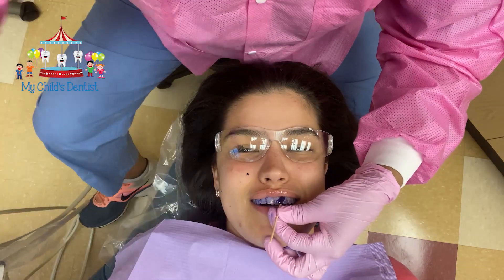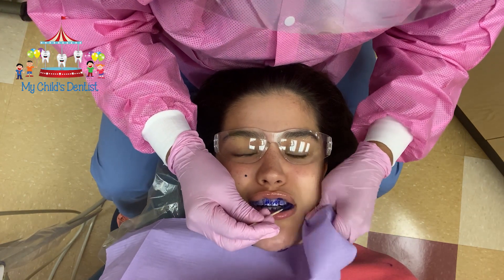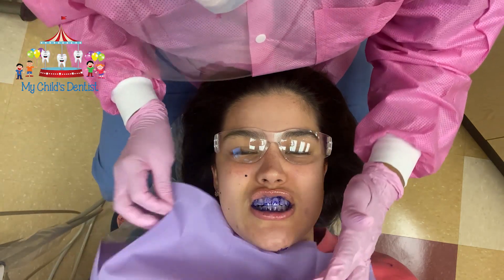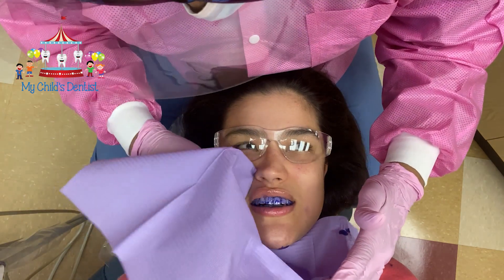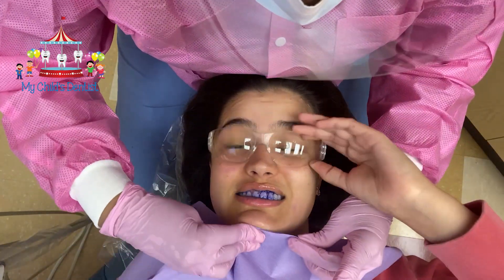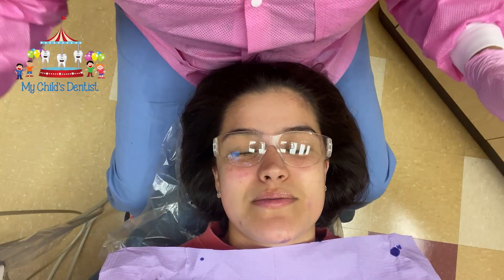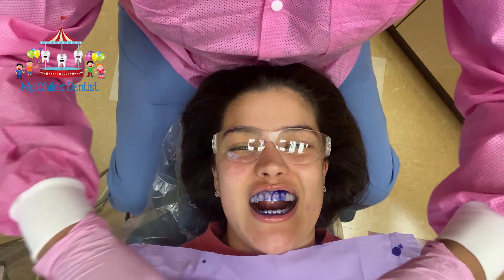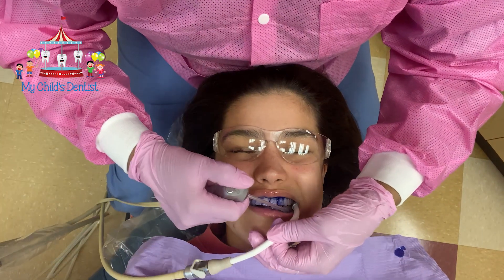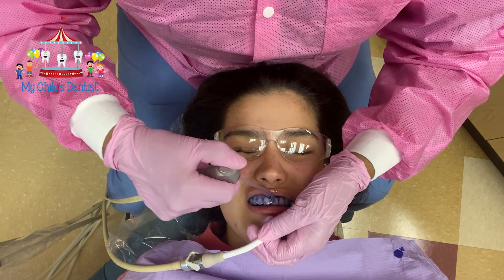I'm going to put a little bit more stain on here — sorry Gabriella — and I'm going to try not to make a mess on y'all. Purple means that the plaque has been there for a long time. Pink — the lighter the pink — is just plaque that has accumulated on your teeth very recently, like since last night or this morning.